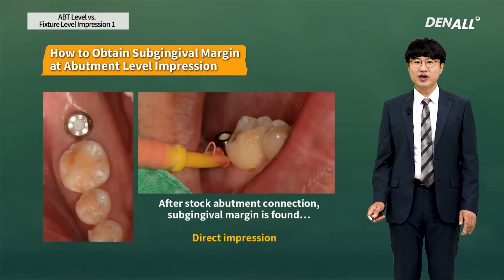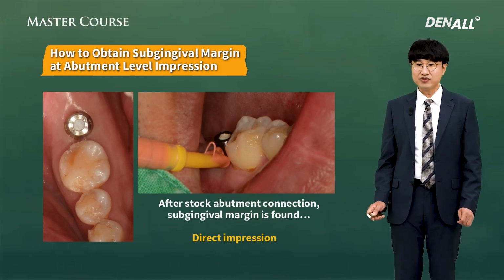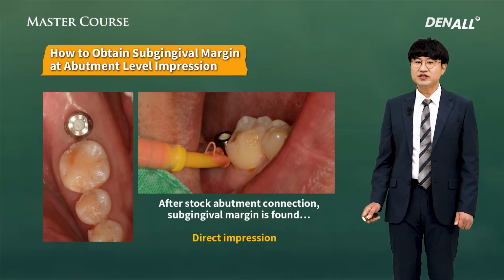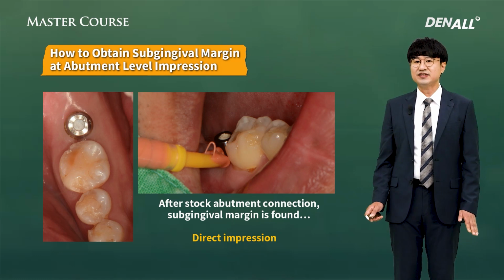Using a stock abutment ensures implant delivery, and for many dentists this is the first choice. So if you can use a stock abutment without modification for a cast restoration, I use this method. After the stock abutment is connected, there's a subgingival margin, but I just take a direct impression up to the area I can see.